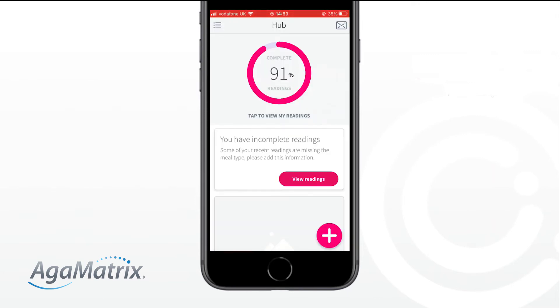Return to the home screen and check that your results are now 100% complete. It is important that all of your readings are complete so that your diabetes care team are best able to assess your condition. Readings are complete when the circle at the top of the screen says 100%. If the circle displayed on screen is less than 100%, you will see a message stating you have incomplete readings.